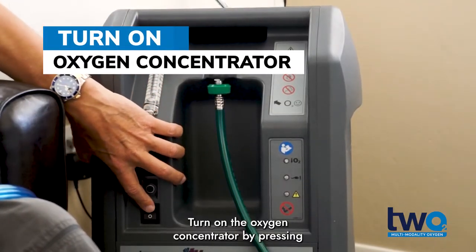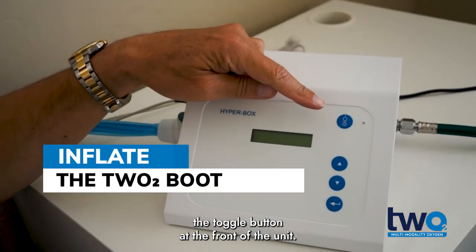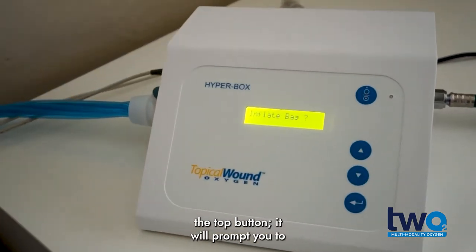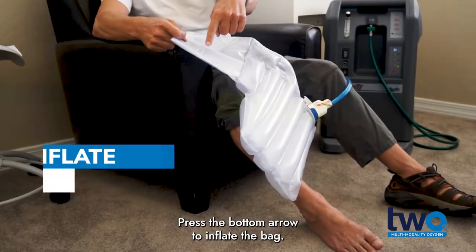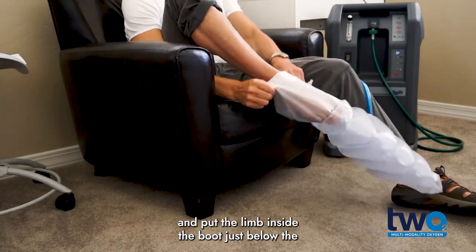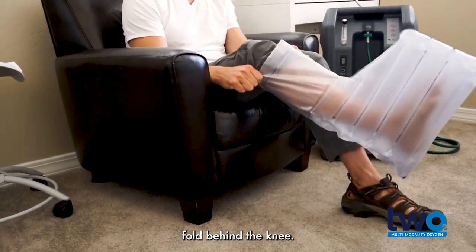Turn on the oxygen concentrator by pressing the toggle button at the front of the unit. Next, turn on the controller by pressing the top button. It will prompt you to inflate the bag. Press the bottom arrow to inflate the bag. Ensure the valve on the cuff is closed and put the limb inside the boot, just below the fold behind the knee.